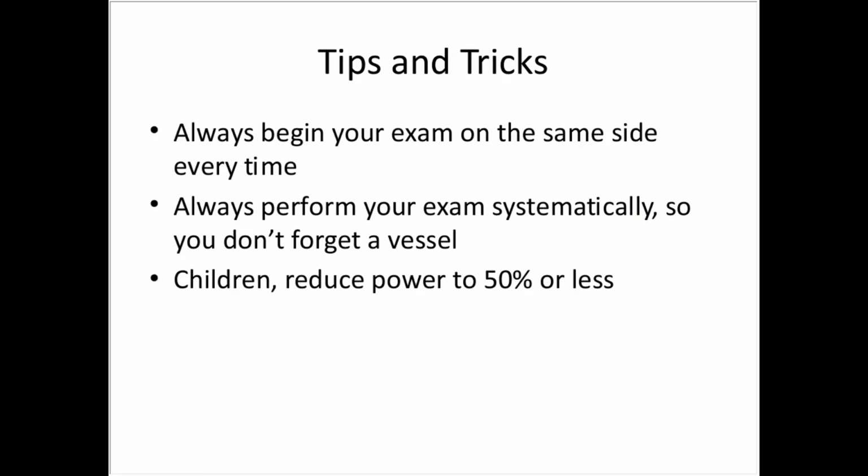Always begin your exam on the same side every time. Always perform your exam systematically so you don't forget a vessel. And if you're doing a child, reduce the power to at least 50% and probably even less.